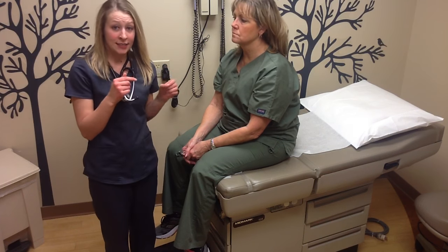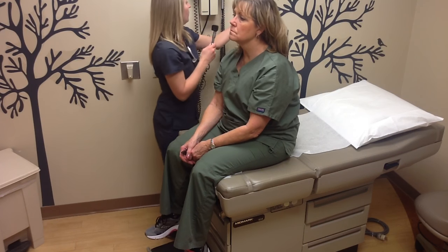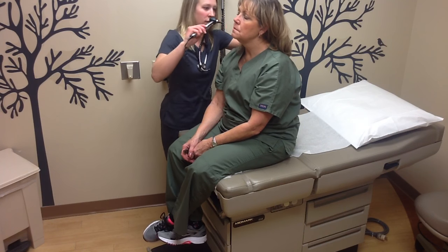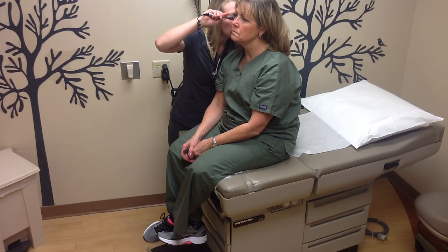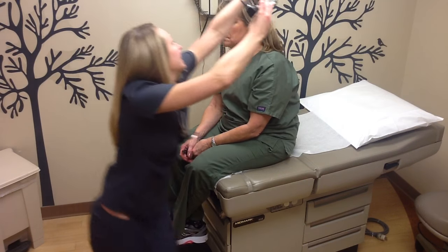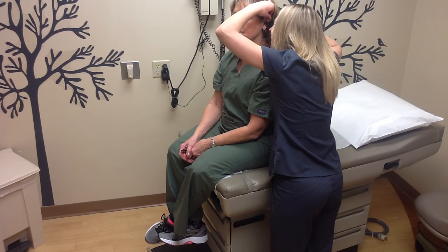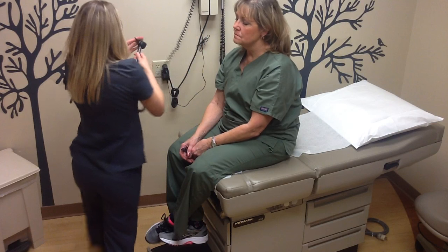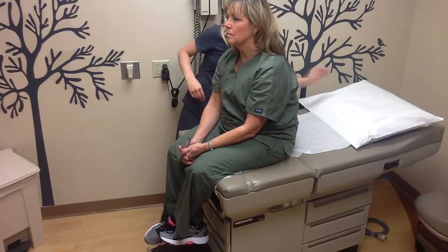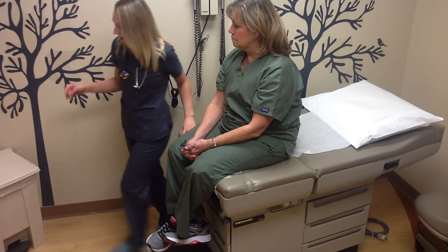Next, I'm going to be looking inside Sandy's ear at her tympanic membrane. All right. Good. And the next ear, sorry. All right. Tympanic membrane is normal, and there is no bulging of the tympanic membrane noted.